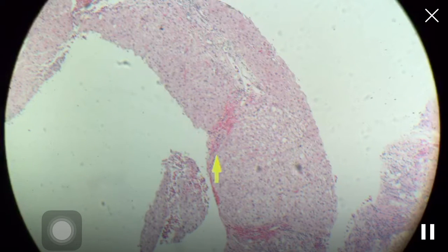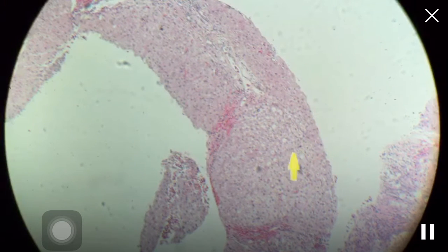Yep. Okay. So we see that there's some fat here. But what was the clinical history on this case? Yeah? So it's a 56-year-old man with a history of NASH and elevated LFTs. Okay, so this is a kind of typical clinical history that one gets.